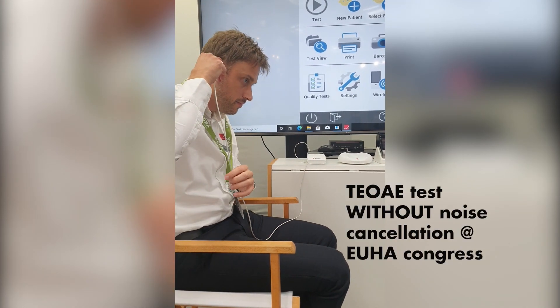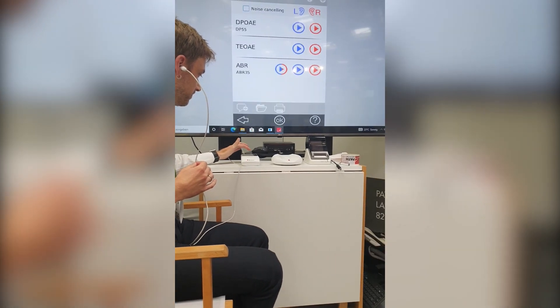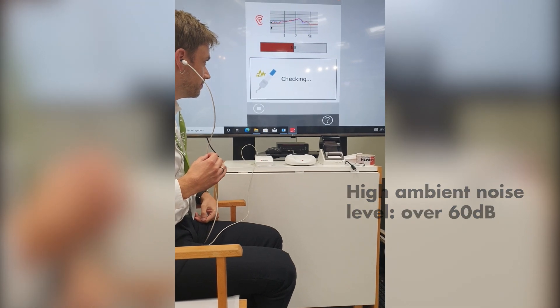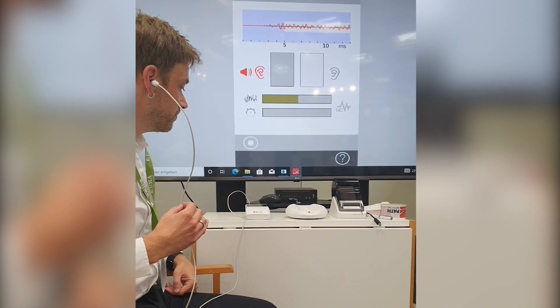Thomas is fitting the probe and we're about to start the test. We're going to select TOE on the right here and we can see the check fit process, and now the test starts.